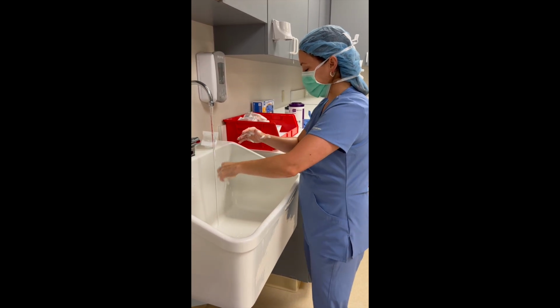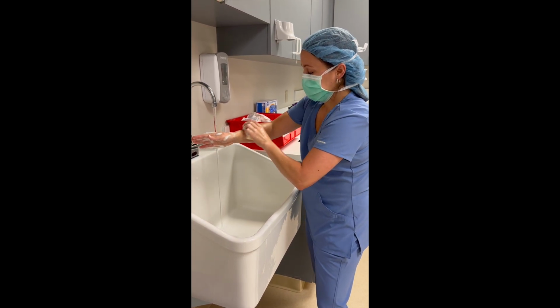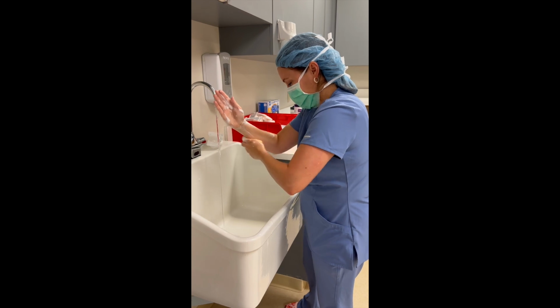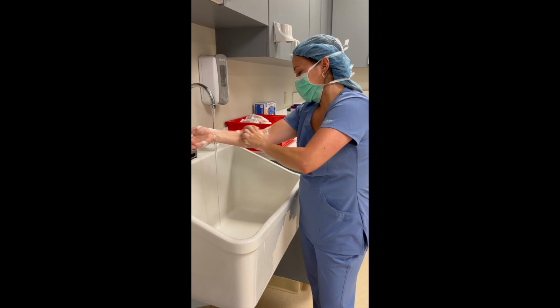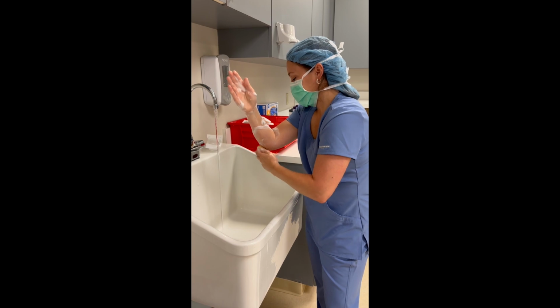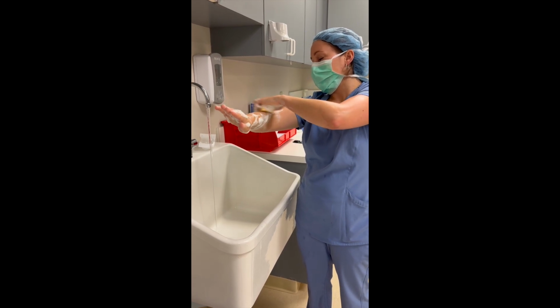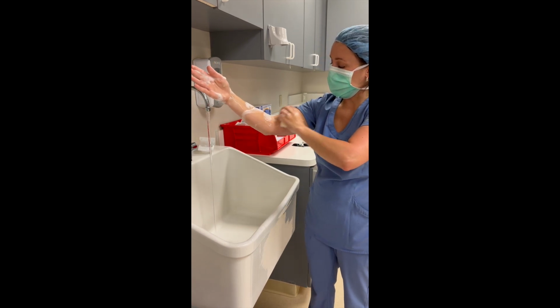Same thing with my forearm. I'm going to sit here. I'm going to break it down in segments. Here, you'll notice I'll have some suds going down my left arm that I just cleaned. That's okay, because at the end, this is clean. That hand's already been cleaned. And I'll just re-rinse it.